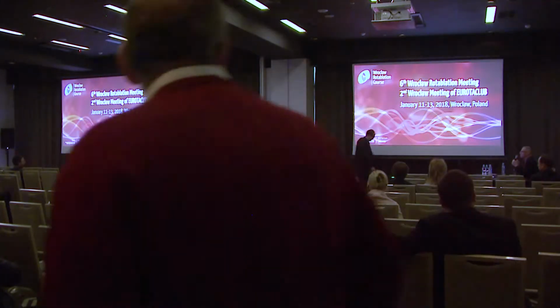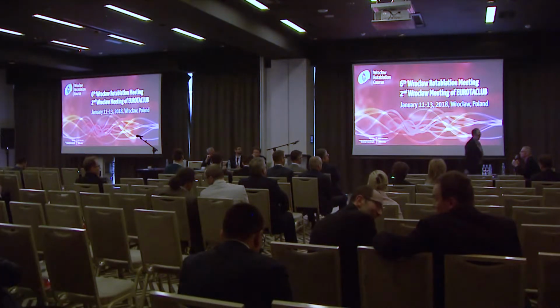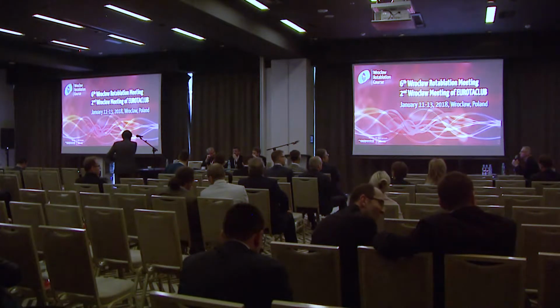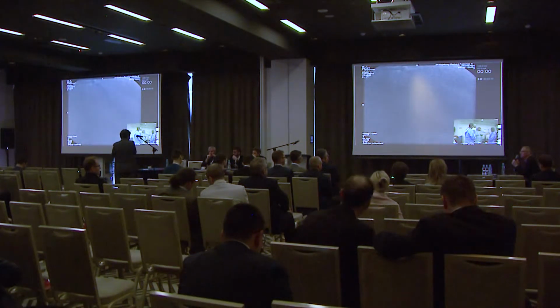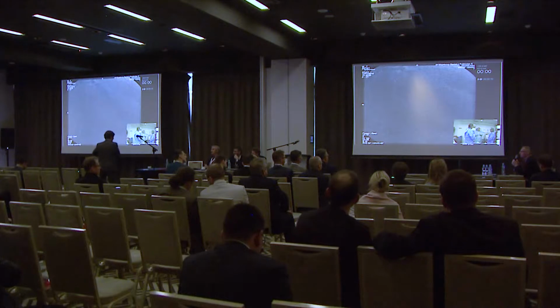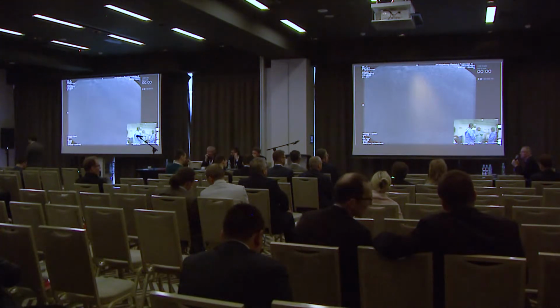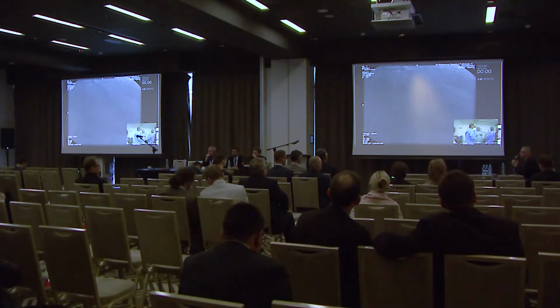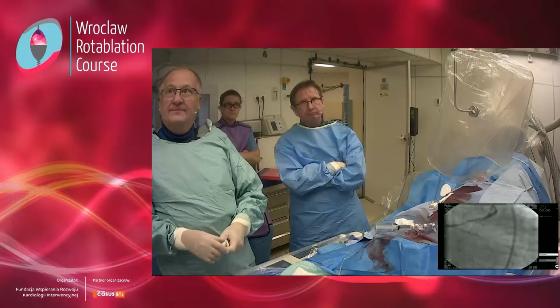So we have the whole spectrum of rotablation indications. Our first live case, it was an undilatable lesion. Our second case, it was an uncrossable lesion, and now we have a primary indication based on the heavily calcified, not only lesion, but heavily calcified whole LAD, heavily calcified artery. And you will leave the circumflex with this subtotal lesion completely? Decision depends on operators.